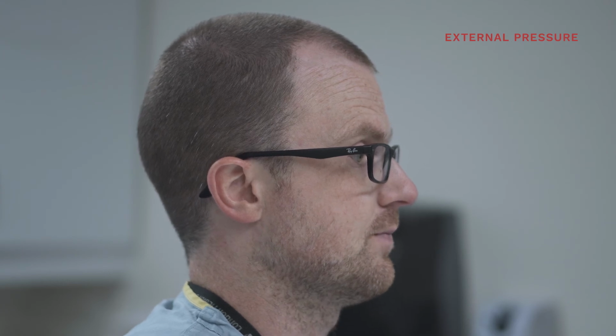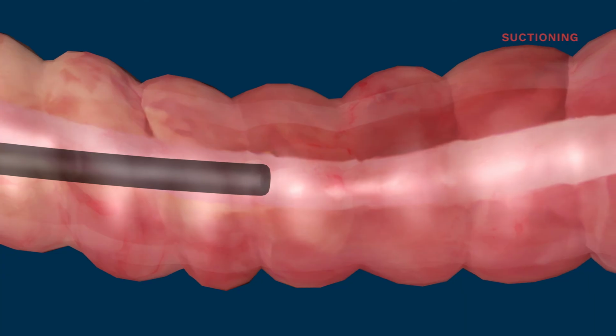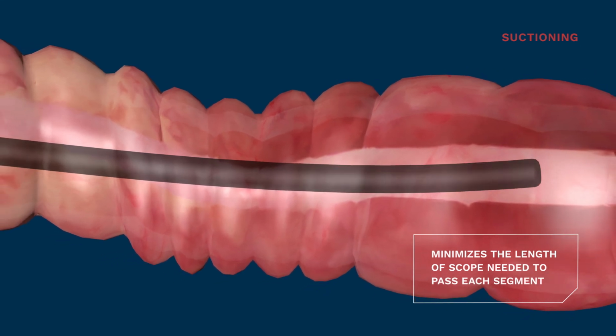Suctioning must be considered not only for helping to cleanse the colon, but also for its role in scope advancement. Consider suctioning anytime you are advancing the scope through the lumen. It helps to accordion the bowel over the scope, minimizing the length of colonoscope that needs to be inserted to pass each anatomic segment of the colon.